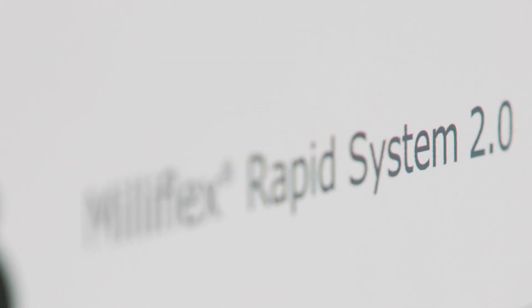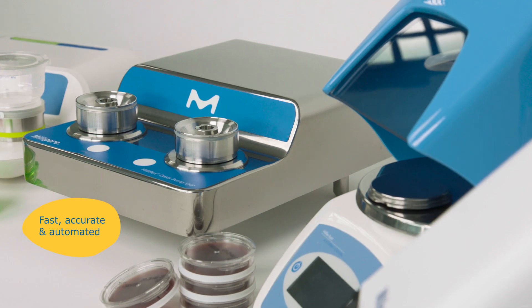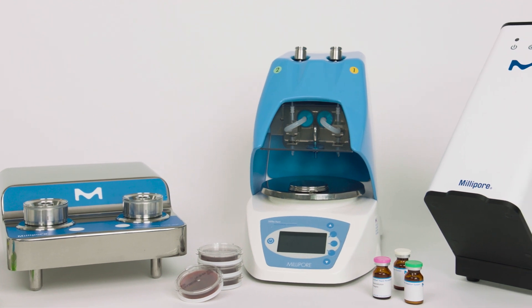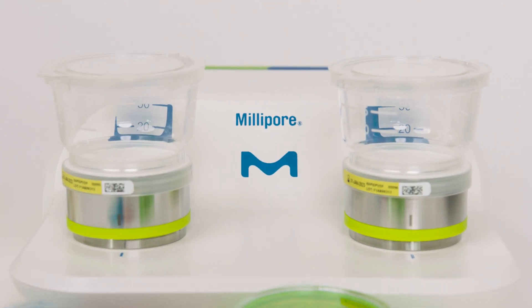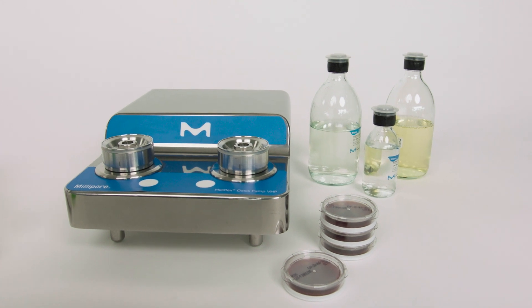The Milliflex RapidSystem 2.0, an automated solution for rapid detection, imaging and quantification of viable microorganisms in filterable samples. Use it under a biosafety cabinet along with the standard Milliflex Oasis pump, or under a VHP isolator with the VHP-resistant pump model.